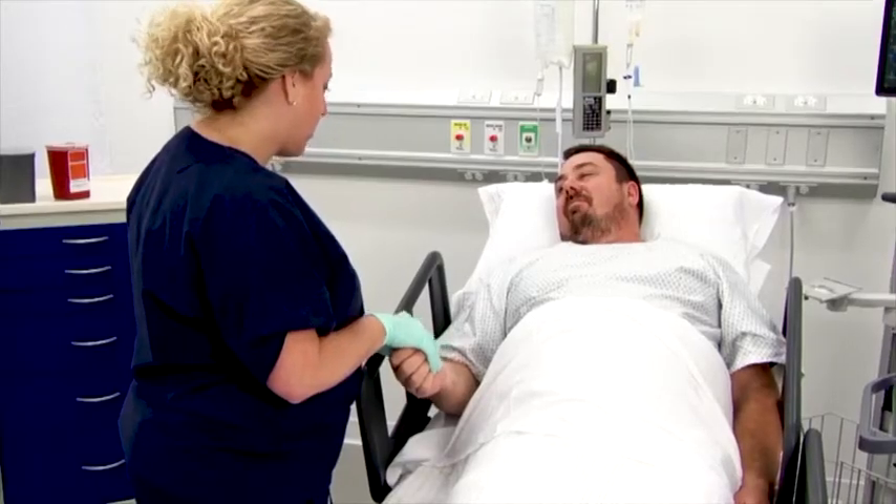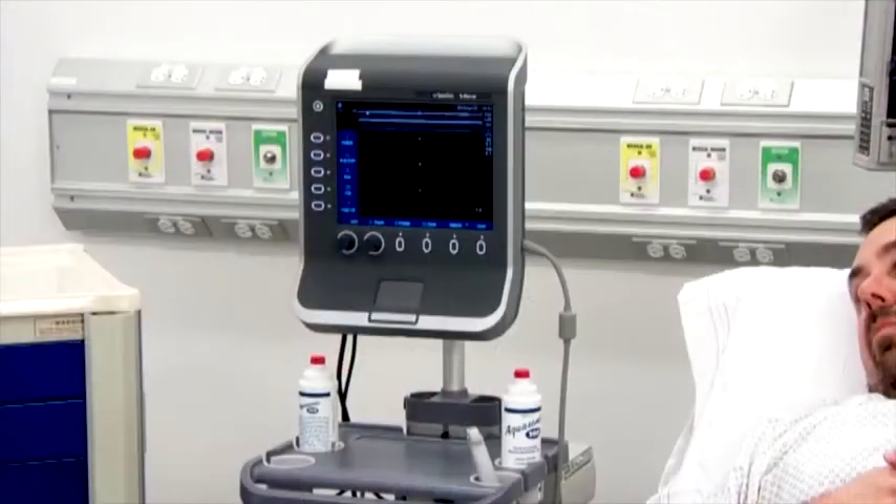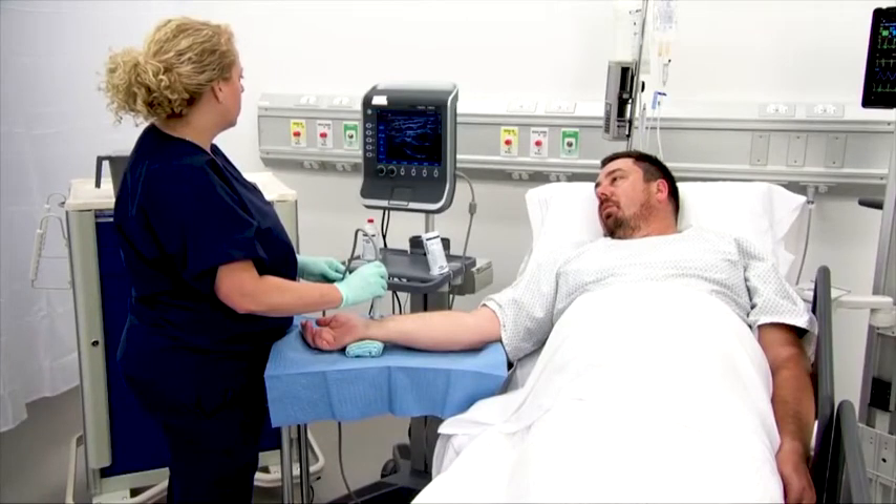To prepare for insertion, adjust the bed to the proper height and ensure that the ultrasound machine is in the proper position and easily accessible. Perform a vessel assessment using ultrasound.